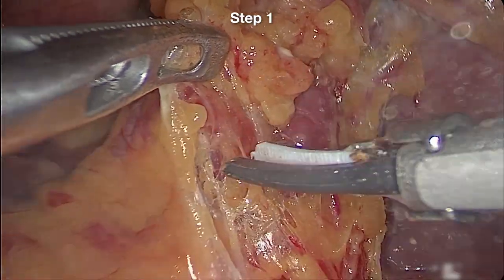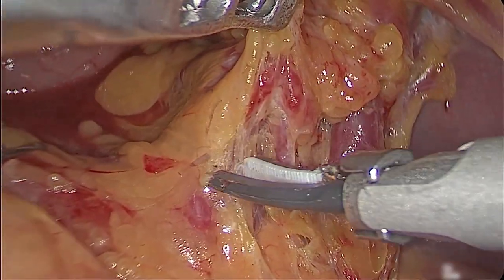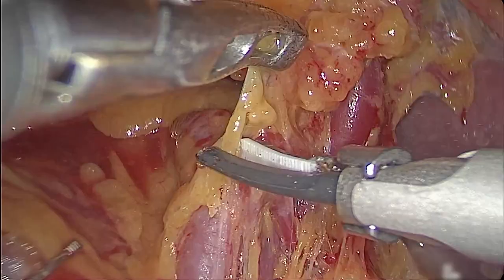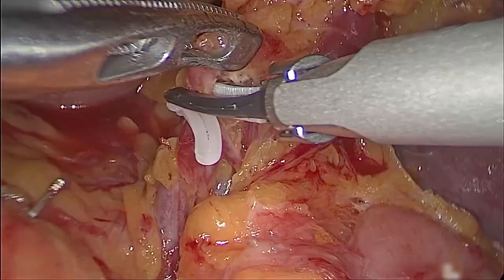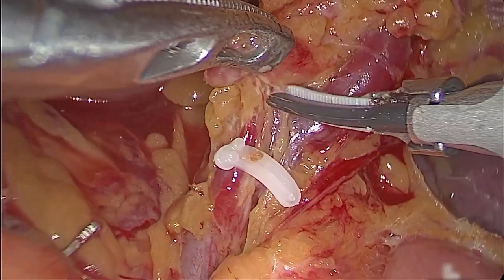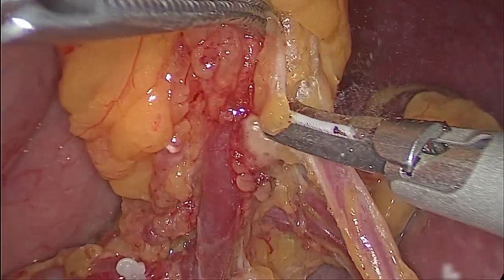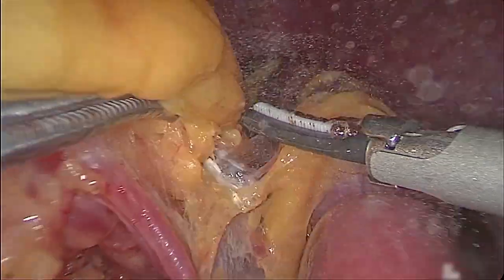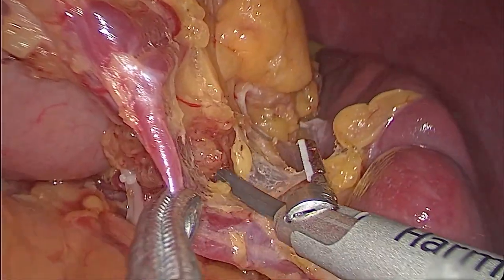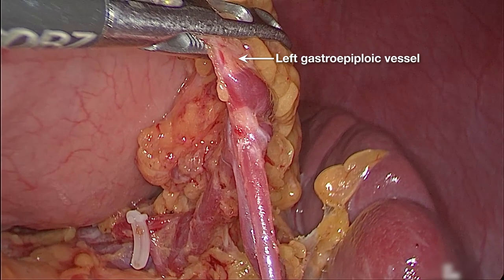Step 1. We divide the gastrocolic ligament from the pancreatic tail to the posterior pancreas space. At this time, we can reveal the inferior splenic lobar artery and dissect the lymphatic fatty tissue along the inferior splenic artery, and reveal the left gastroepiploic vessels.